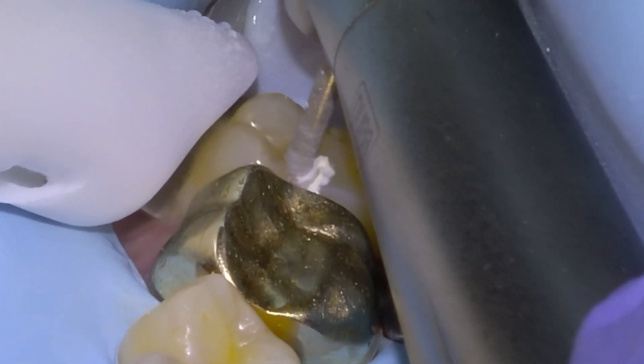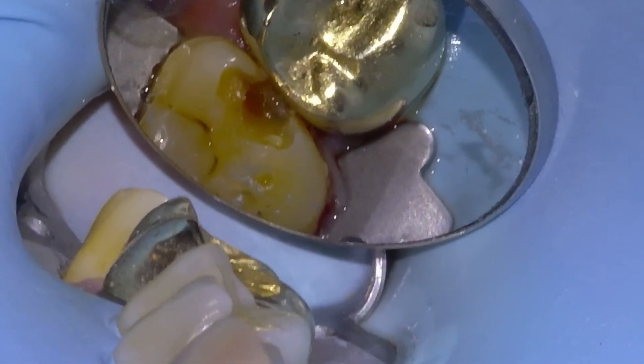We'll get opening up the tooth with a KS1 burr on a high speed. You can see some tooth decay in there. They're not going to be too deep though, but we'll open up the contacts here, opening up the lingual and the buccal until we can see daylight.